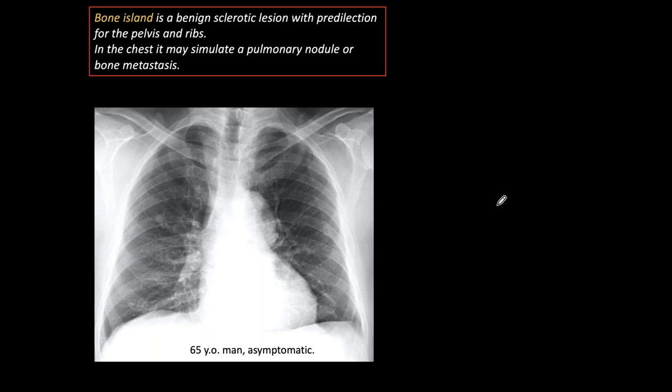The next condition, which is reasonably common in the chest, is bone islands. Bone islands are sclerotic lesions with predilection for the pelvis and ribs. When they occur in the ribs, if they are not very obvious, they may simulate a pulmonary nodule or a bone metastasis.